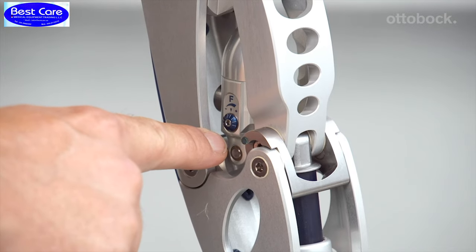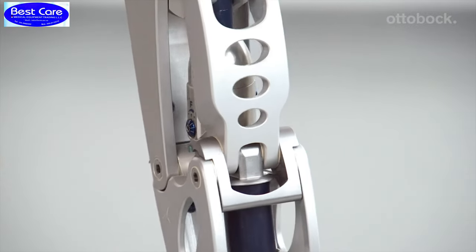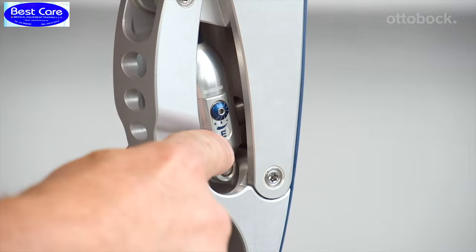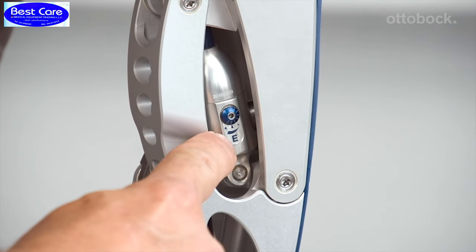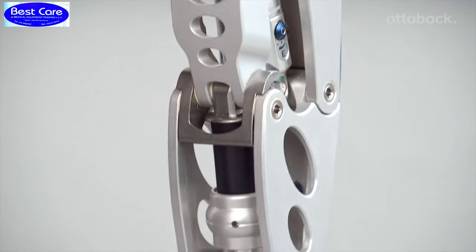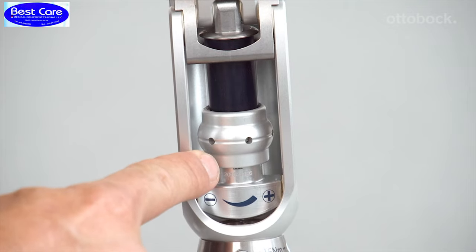The following adjustments can be made with the 3R60. Both flexion and extension can be separately adjusted to the user's requirements. The hydraulics controls the behavior of the knee joint during the swing phase. In conjunction with its polycentric joint kinematics, the EBS provides notable stance phase stability.